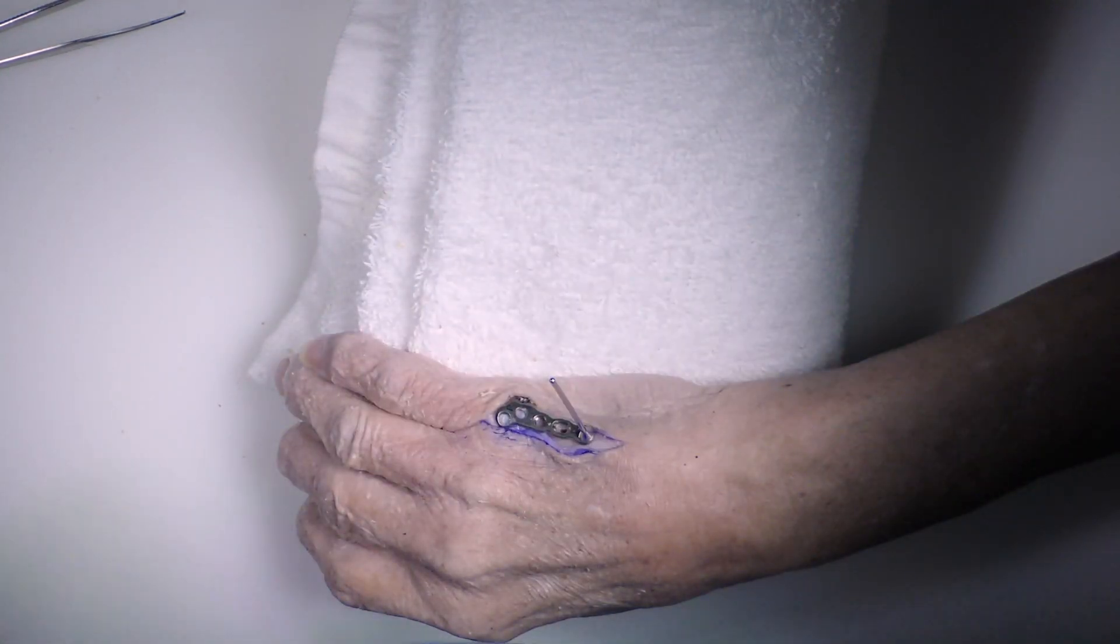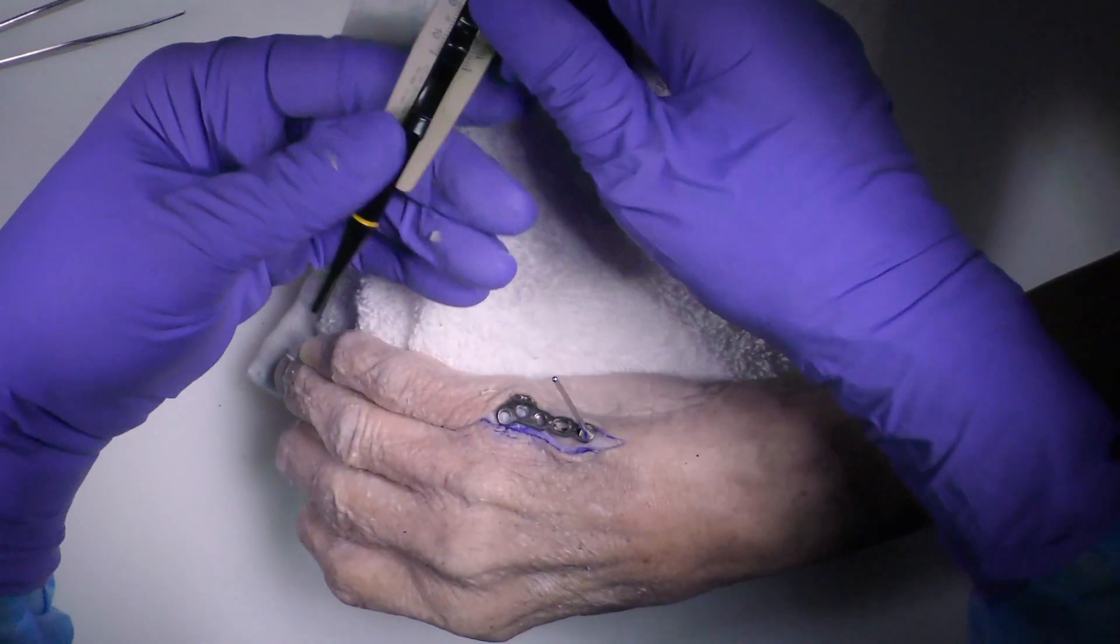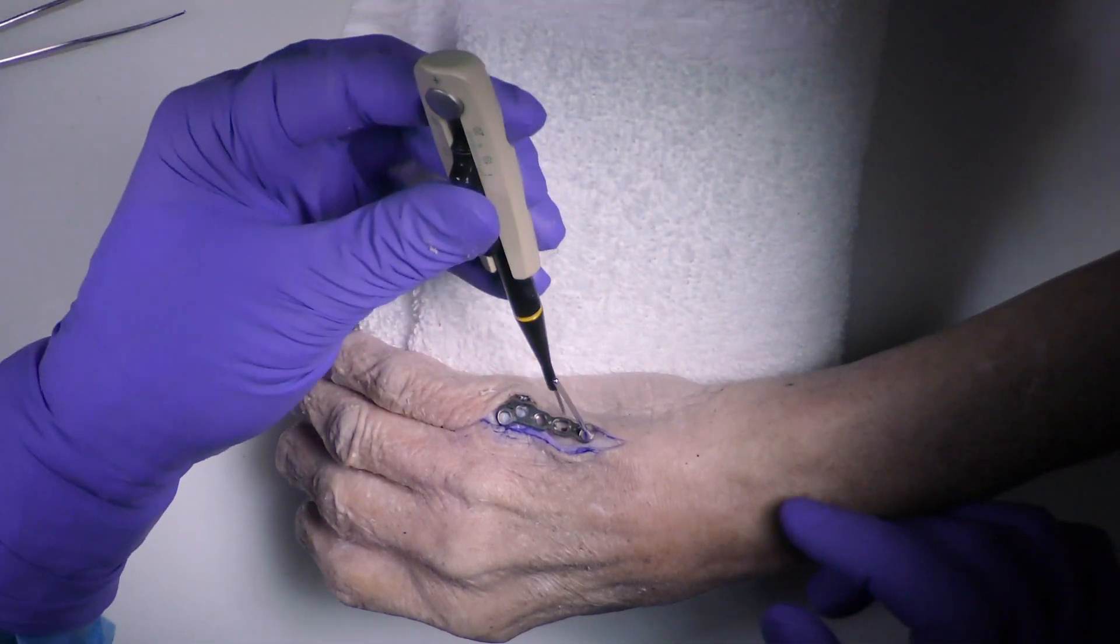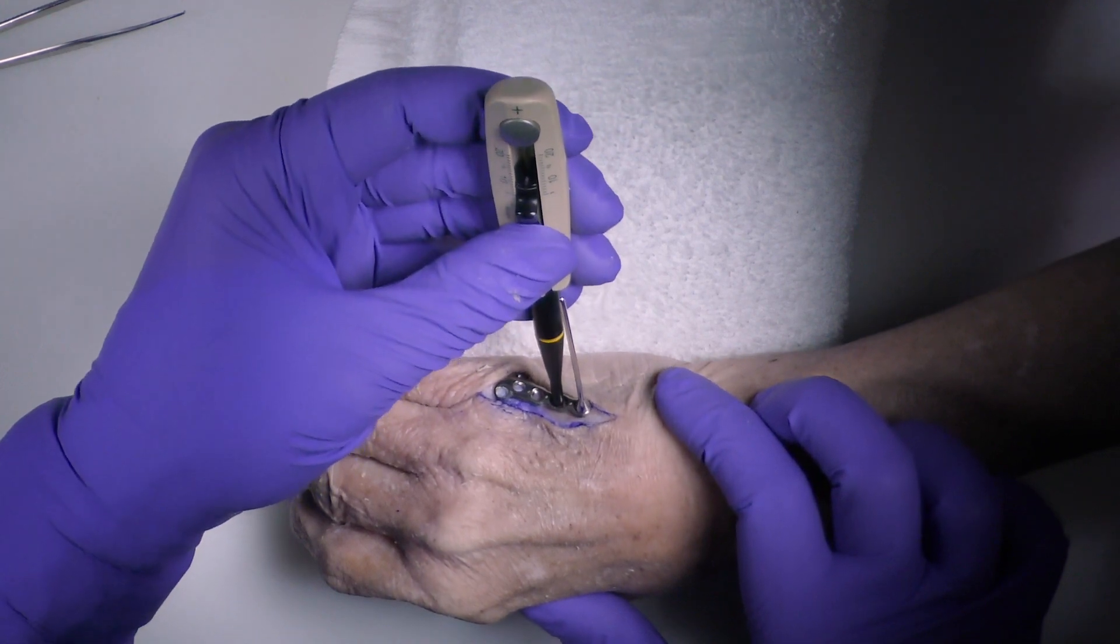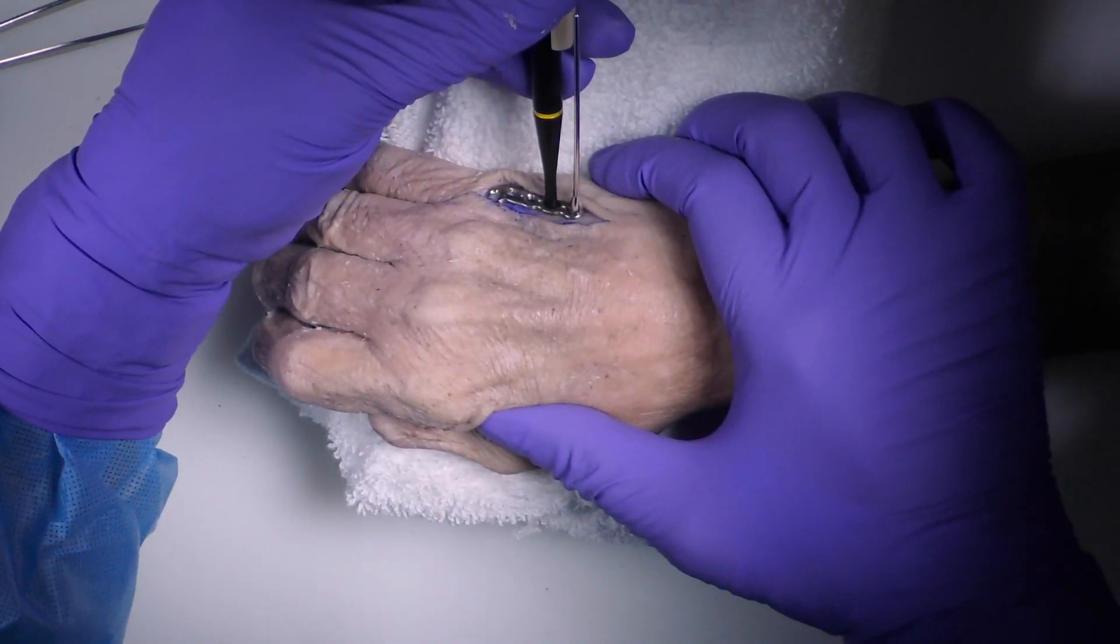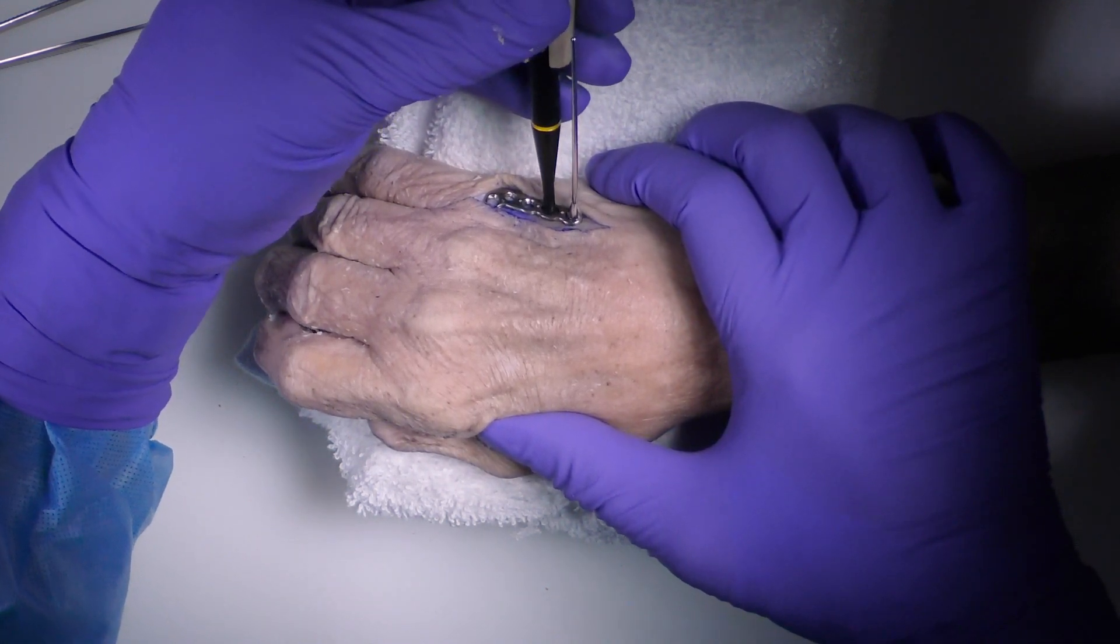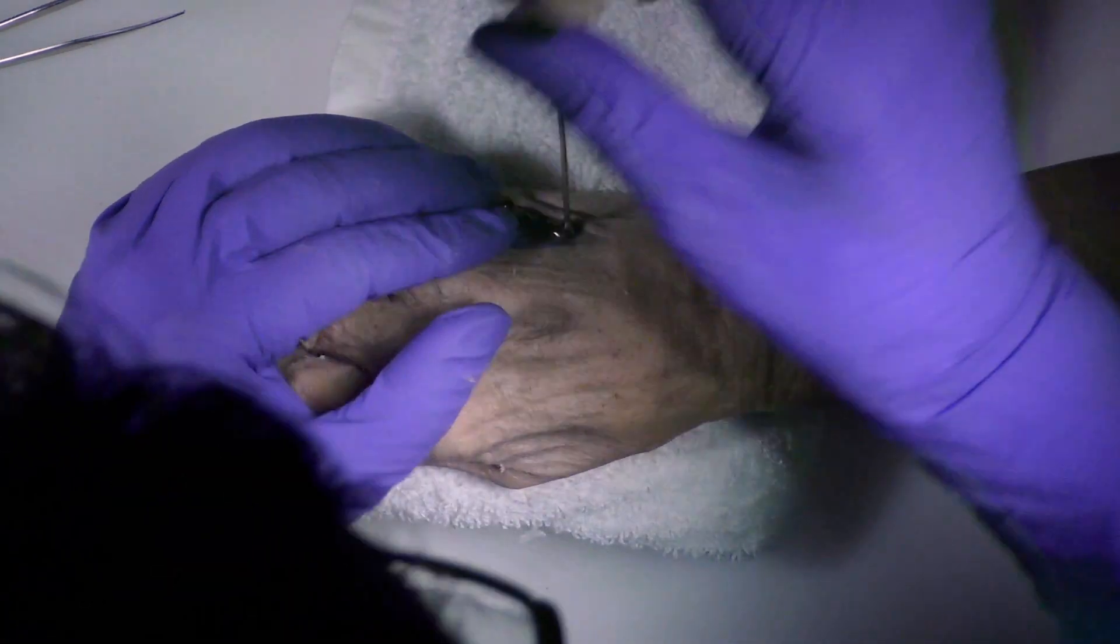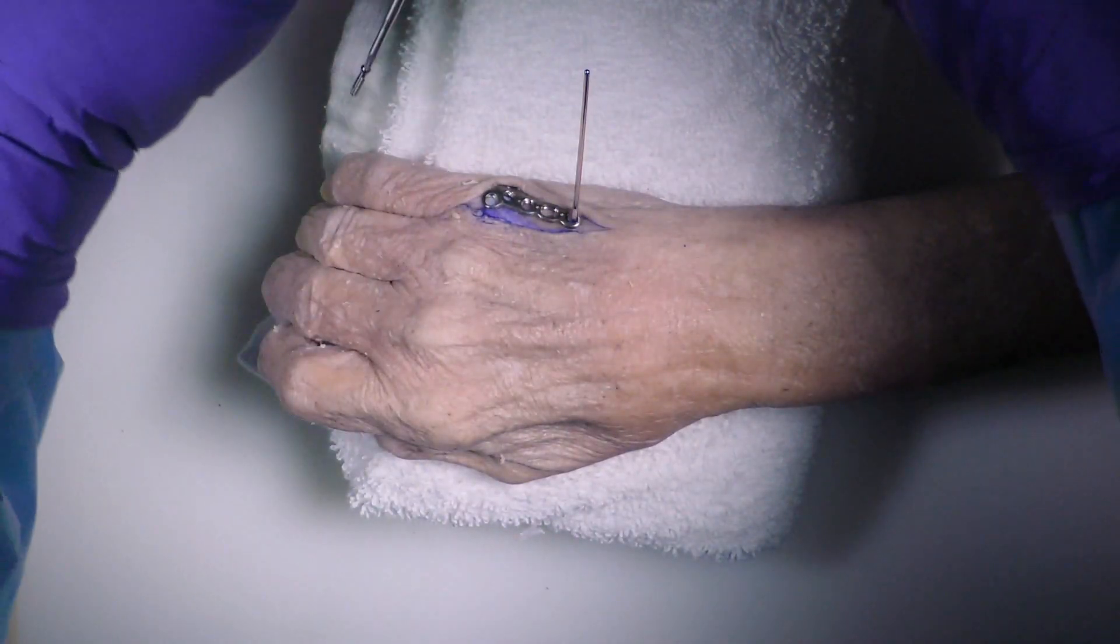Measure it. These are usually in the region of ten-ish plus or minus two millimeters. I'm measuring an eight and a half, I'll take a nine cortical screw, please. Thank you. I'll use a non-locking screw here.